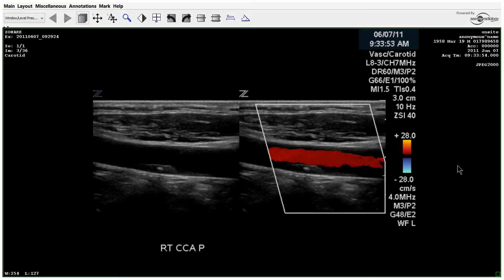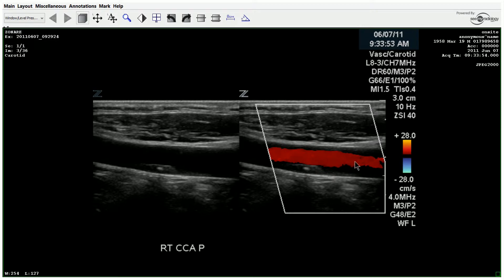Here in the longitudinal view, we have the color scale set at 28, and they take a longitudinal view of the CCA. You'll notice a hypoechoic, focal plaque here with a focal area of starting calcification, but it doesn't appear to be causing any significant velocity or flow changes. You can see the color is nice and smooth, it's set at a good scale, and there's no aliasing on either side of that plaque.